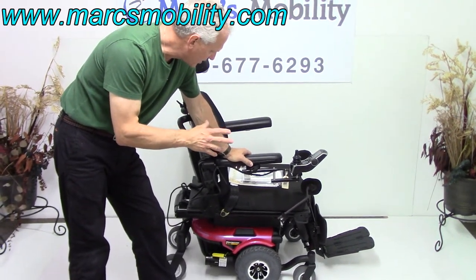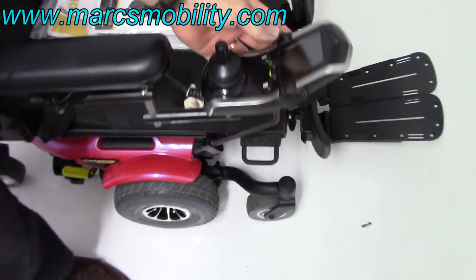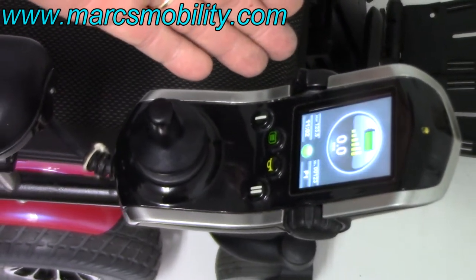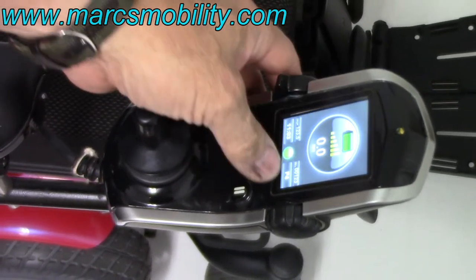All the functions on this chair can be worked through the joystick. You turn the power on with the left button — pushing the left button forward, your power will come on. Then usually it comes on speed number one, which says P1. Speed two, push it forward. Speed three, speed four.